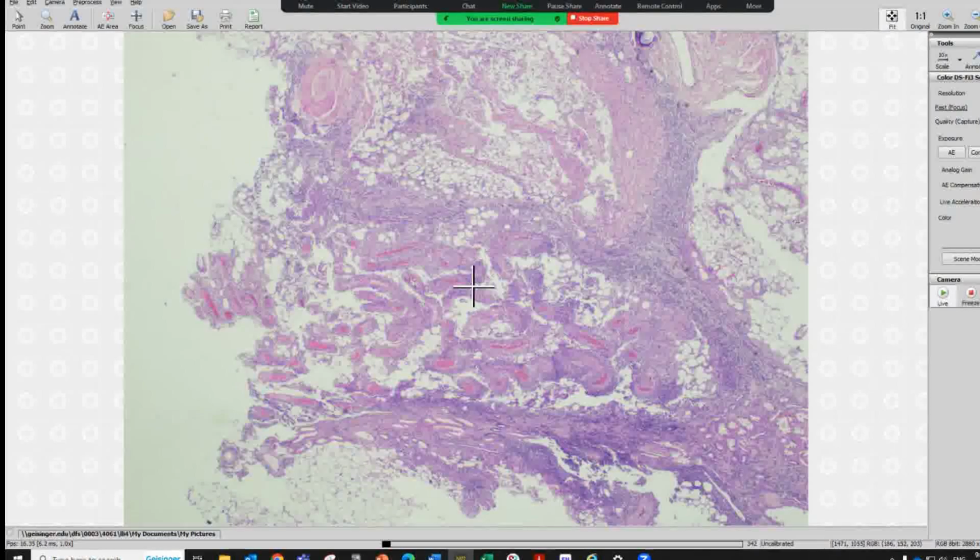So this is another AML, angiomyolipoma. We also can see this bubbly perivascular epithelioid cell trying to hug the vessel wall. The reason I would like to say this again and again is because I want you to be familiar with this term, perivascular epithelioid cells. So this is the AML.